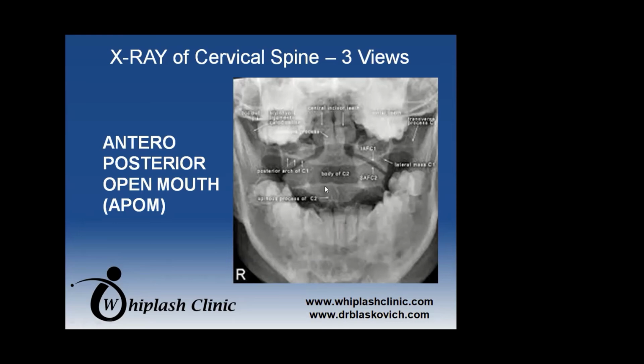And then we get down here, and there's that A-frame I was telling you about, that bifid spinous process that belongs to C2, which is an important structure when looking at imaging without these words embedded on there showing what the anatomy is. And then there's a side edge to the lateral mass that drops down, which should line up with the side edge of the side of C2 on either side. The wording gets in the way here, but these two are lined up as well. And that's kind of the gist of the majority of things that one should see in there.